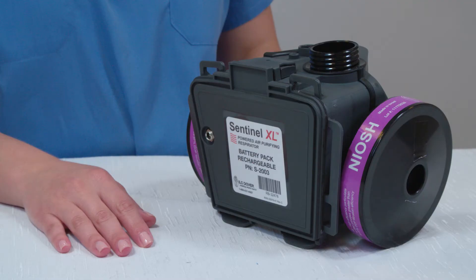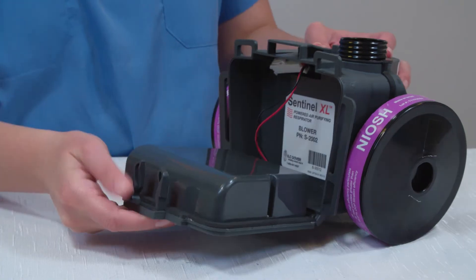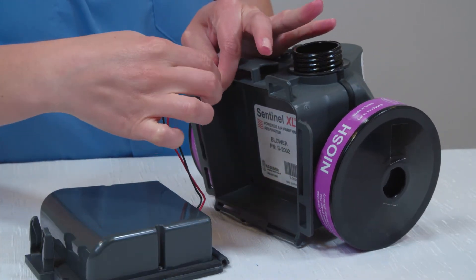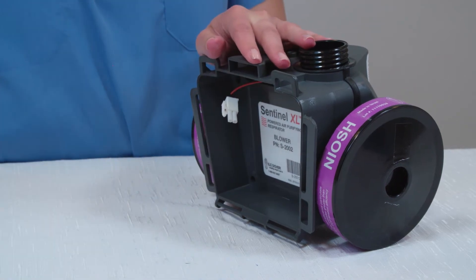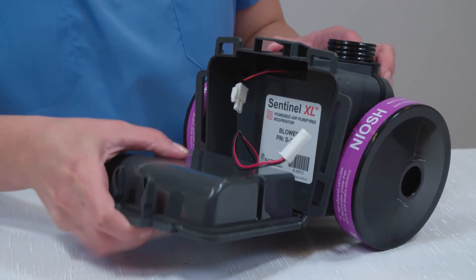As mentioned earlier, the Sentinel comes with an integral yet removable battery pack. To remove the pack, unlatch the securing clip and then disconnect the wiring harness as shown. The battery harness is now separated from the blower. To replace the battery, simply reverse the procedure.